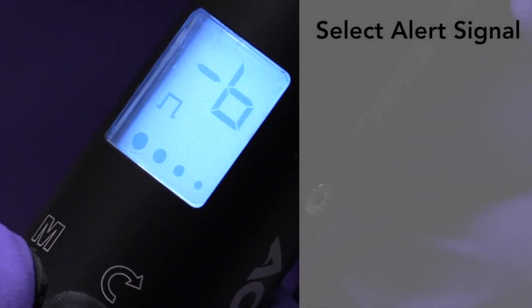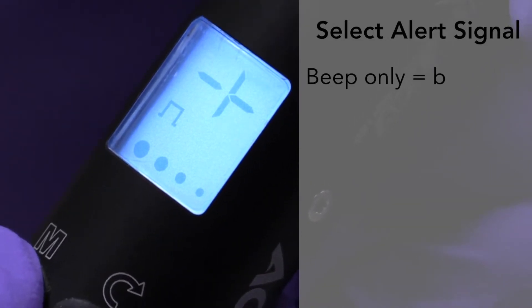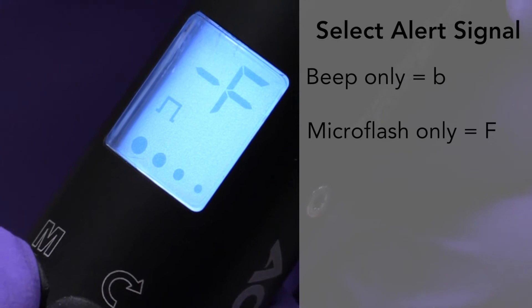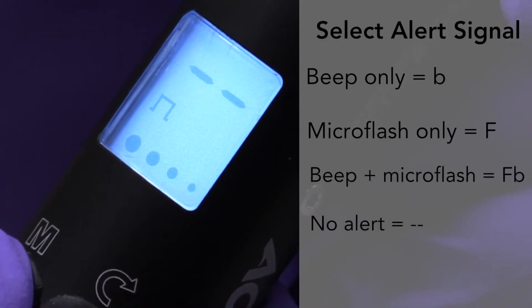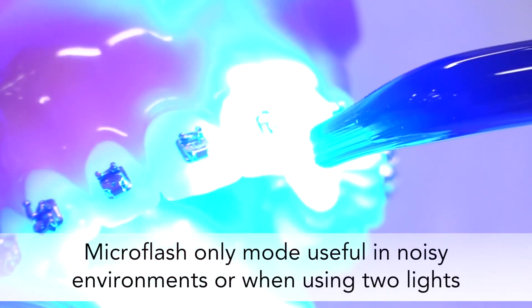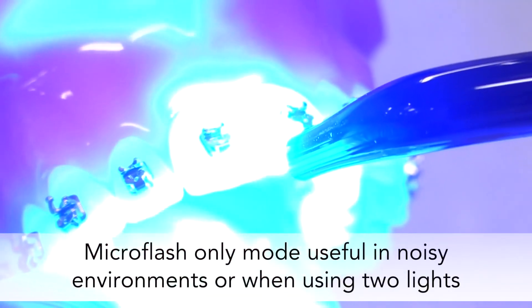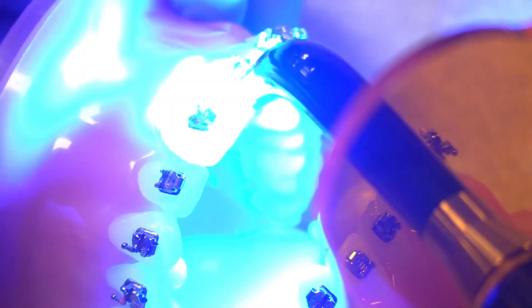Next, set your alert signal by pressing the left button. You can select beep only, represented with a B; microflash only, represented with an F; beep and microflash, represented by FB; or no alert, represented by two dashes. The microflash only mode is particularly useful in noisy environments, to avoid confusion whenever two lights are being used, or simply for a quieter office environment.